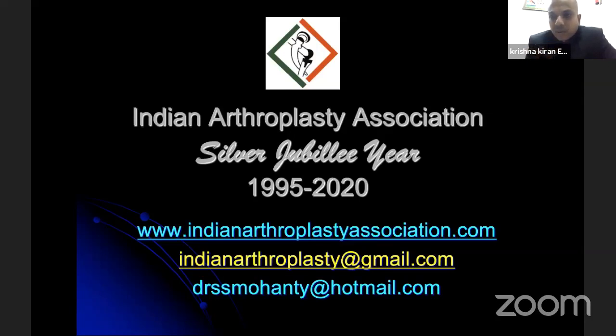Second, if you do a lengthening through the epicondylar osteotomy or a partial lateral condylar osteotomy, since you're not lengthening at the level of the joint, there are reports in literature saying that the possibility of peroneal nerve injury could be lesser, because if you do a release at the level of the joint and stretch it there, or you do it through the bone and get the tissue down, the risk of peroneal nerve injury could be theoretically lesser. I have no evidence on that, but there are a couple of reports on the role of partial lateral condylar. So I would like the opinion of the house on that.